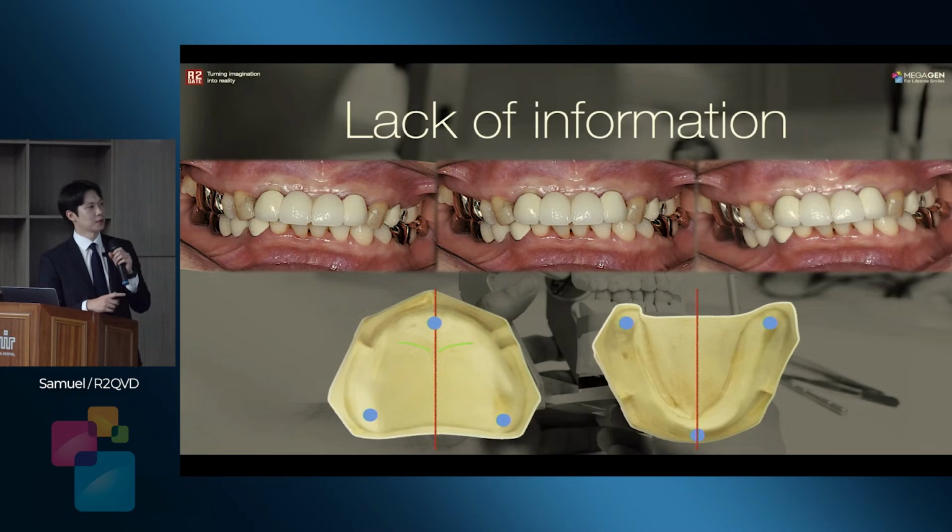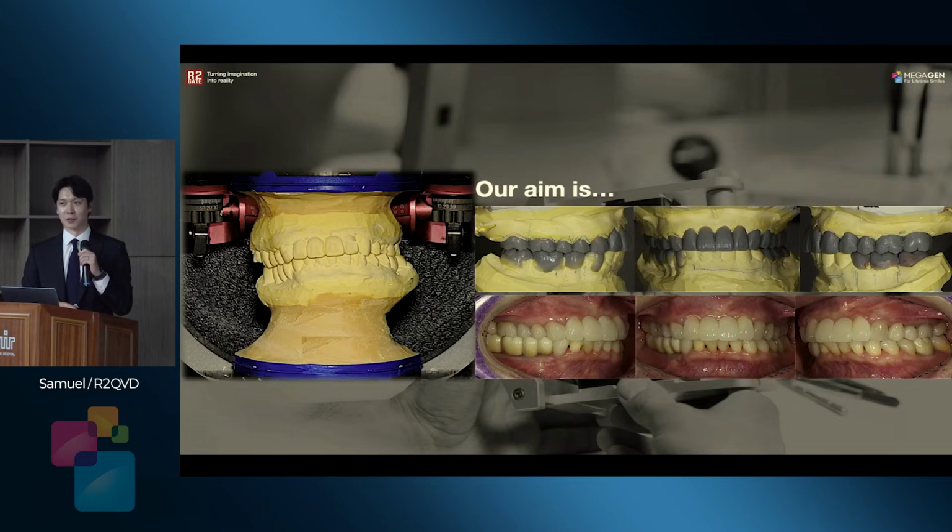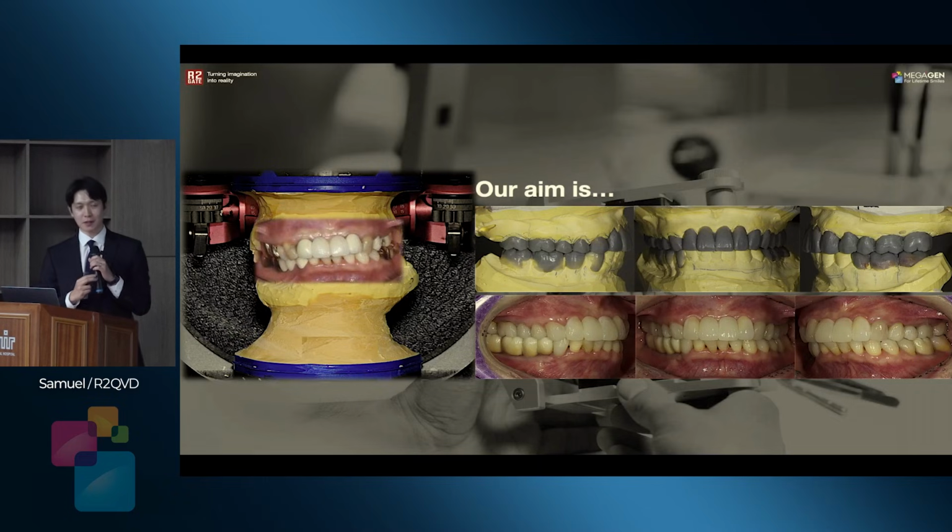And I just chose some arbitrary reference. Then I designed the crown, something like that. Okay, good, looks very nice. But the original is different. The third one is correct. That's why I'm stupid. So it's only a 4-unit bridge crown.